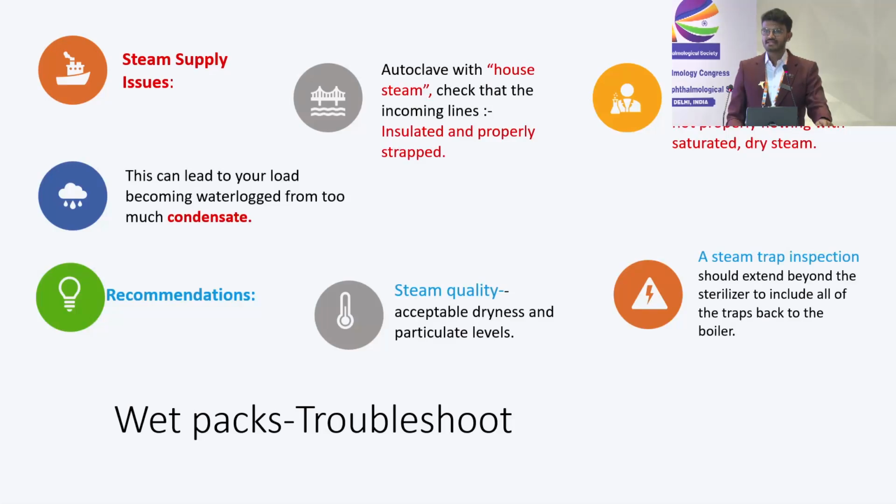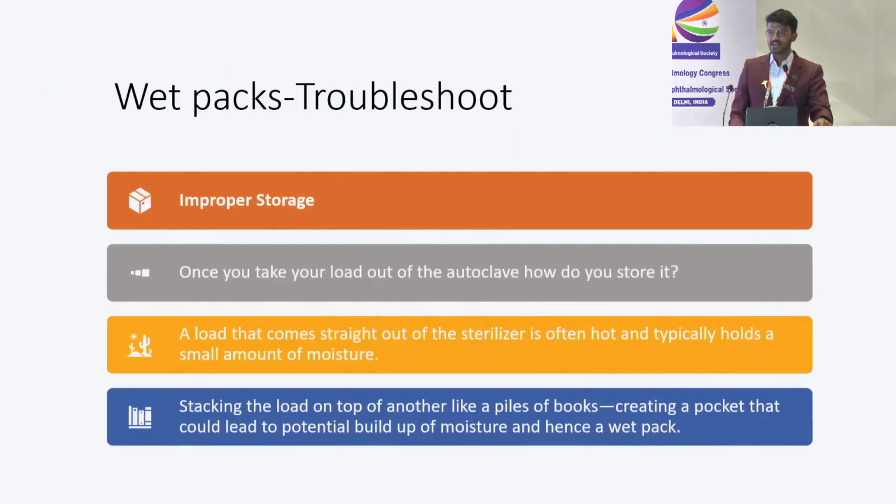And lastly, the steam supply issues are to be taken care of by making sure you have proper maintenance of the equipment and providing adequate pressures and all those criteria to be satisfied. So lastly, how do we troubleshoot it?